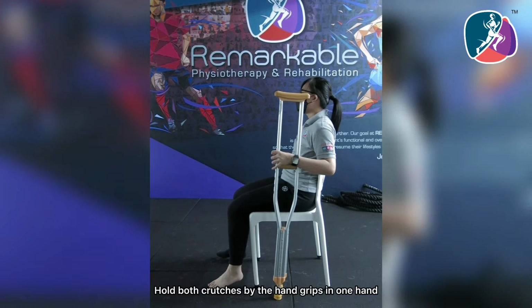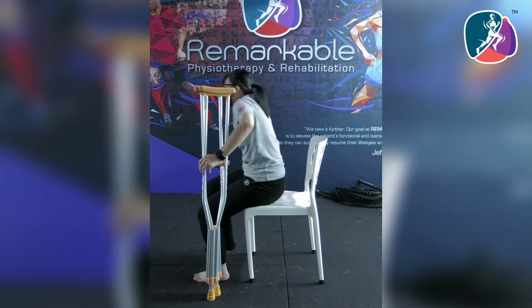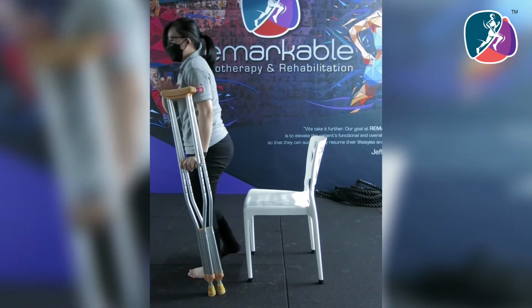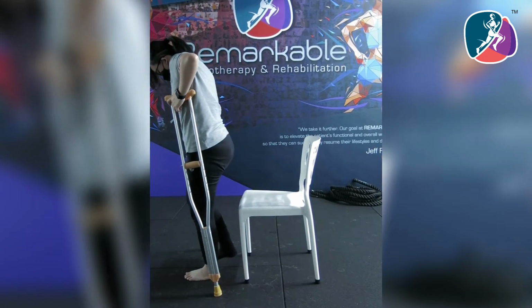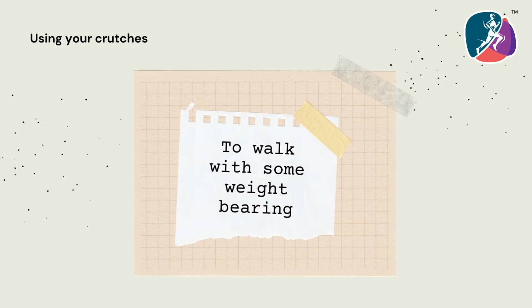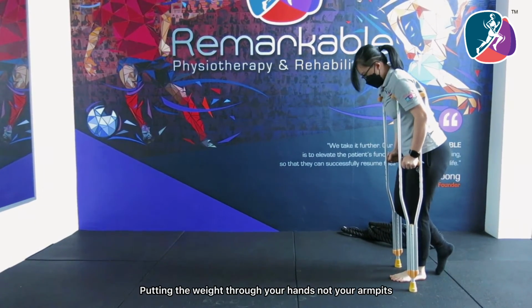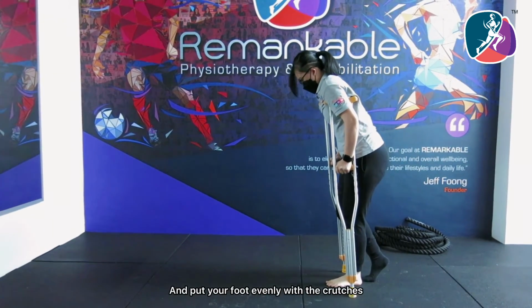To stand up, hold both crutches by the hand grips in one hand and push up with your other hand on the chair. To walk with some weight bearing, take a step, squeeze the crutches between your upper arms and ribs, putting the weight through your hands, not your armpits. Move the crutches forward, move your injured leg forward and put your foot even with the crutches.